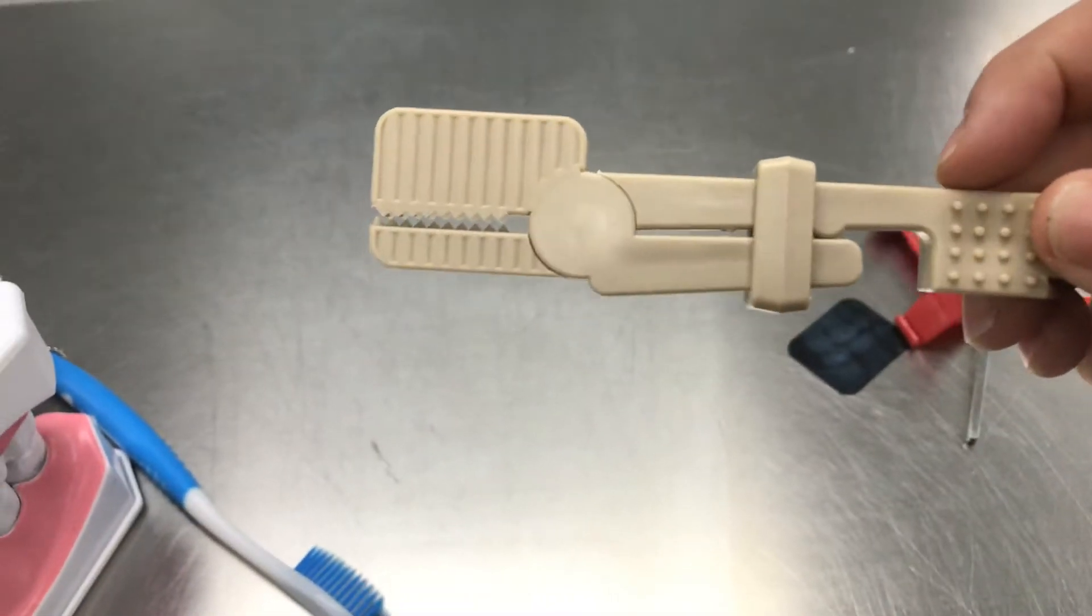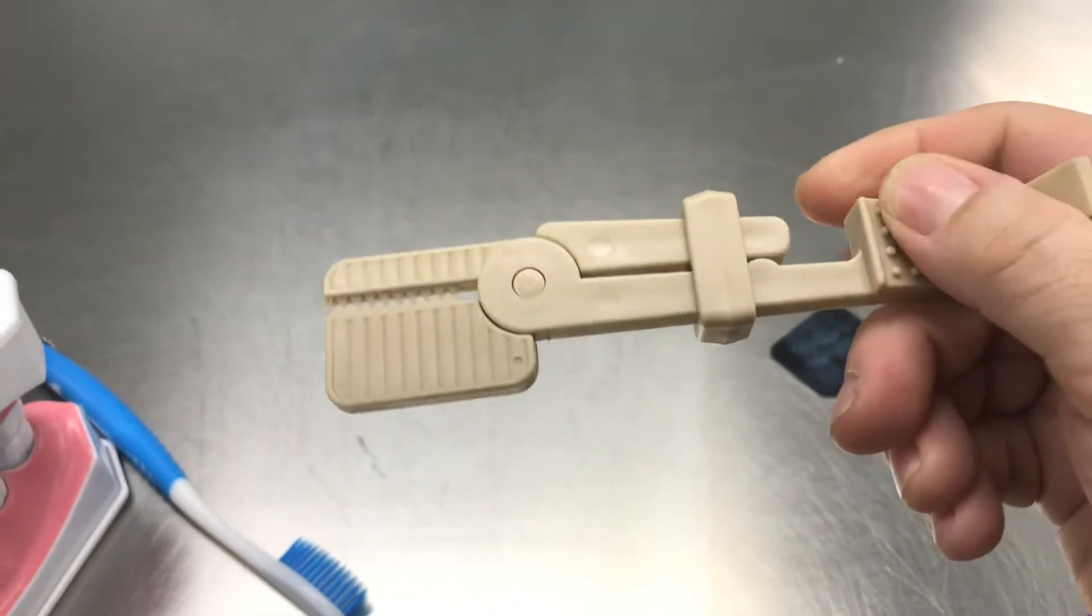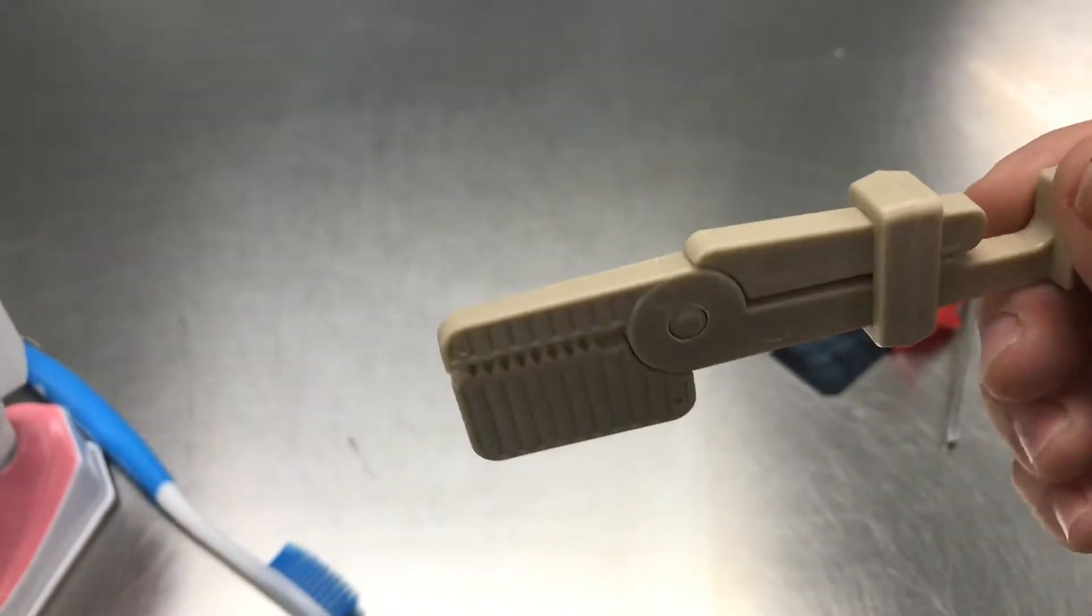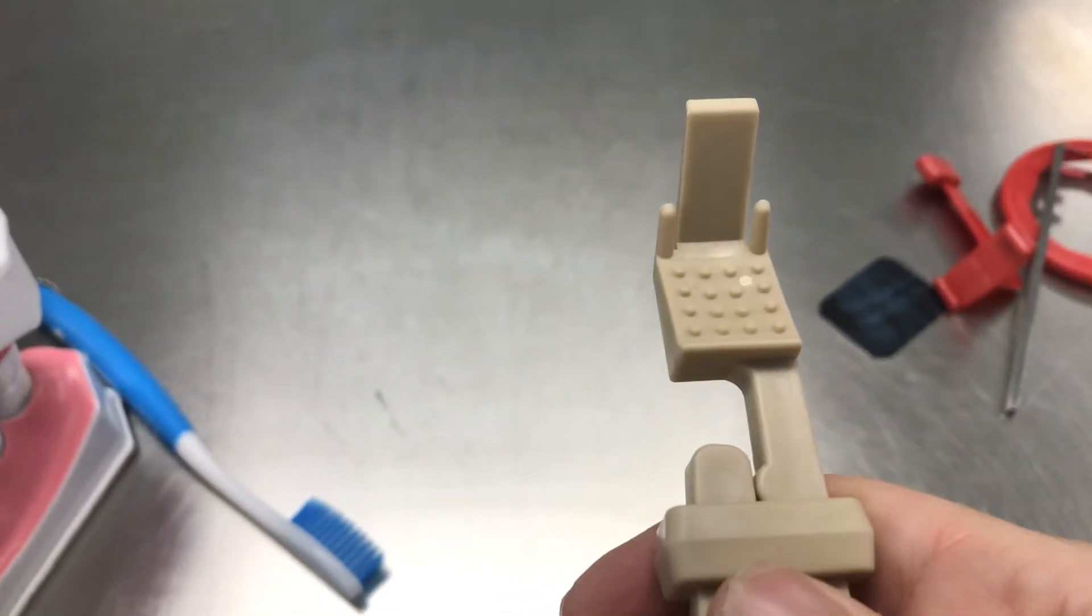This is called a snap array x-ray holder. This is what I started with. We use this for the posterior teeth, and then you use this side for the anterior teeth.